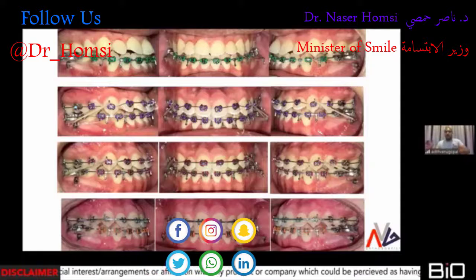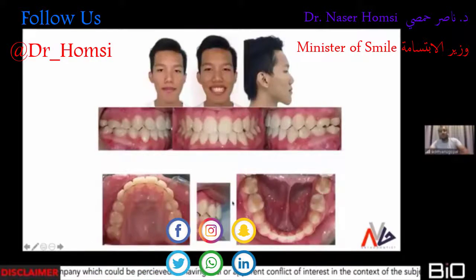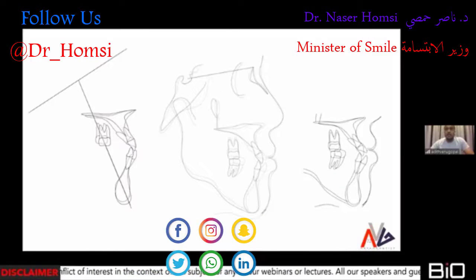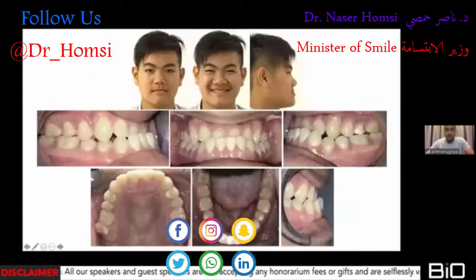What I'm trying to show is that you could use any kind of bracket. You can use even a conventional bracket with modules to get the same desired result. And as you can see, the case was finished. Smile aesthetics have improved, but the case is still a surgical case. The patient did not agree for surgery. And you can see the amount of controlled tipping around the center of resistance of the upper incisor and the retraction and the tipping on the lower incisors as well in this particular case, which is evident in the superimposition.